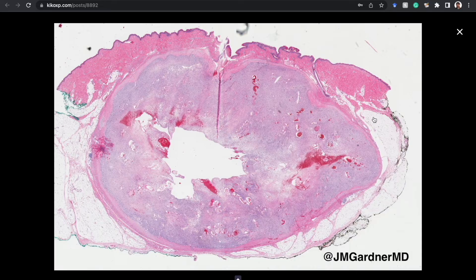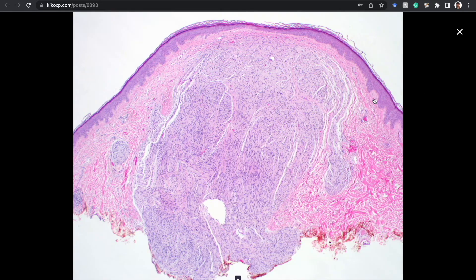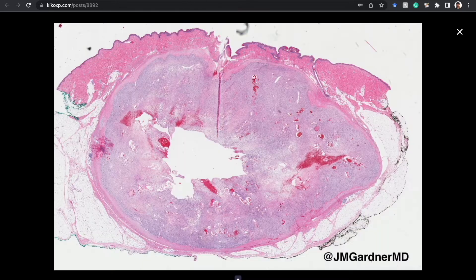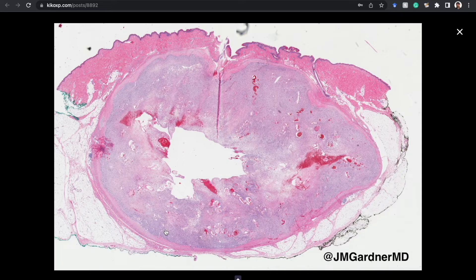If something looks like a schwannoma and it's in the dermis only, it could be — but the much more likely diagnosis is palisaded encapsulated neuroma. We'll come back to that in a moment. First, in this case you can see cystic change, hemorrhage, hypercellular and hypocellular areas, and a nice capsule — all the features I described.